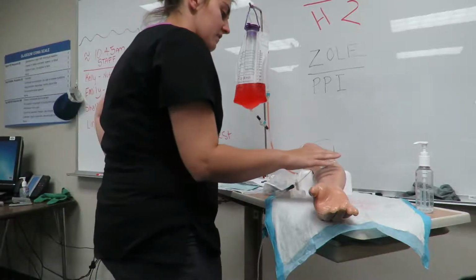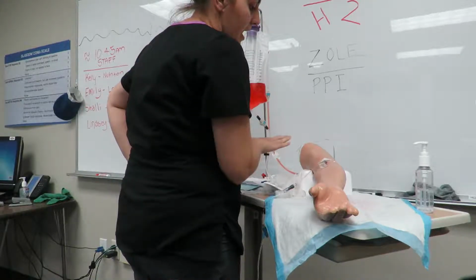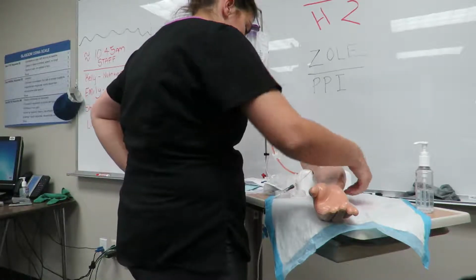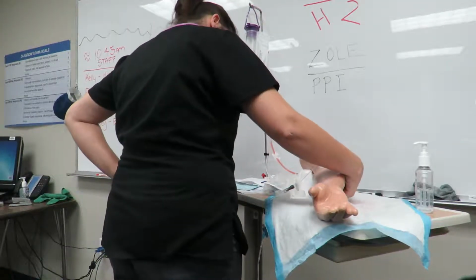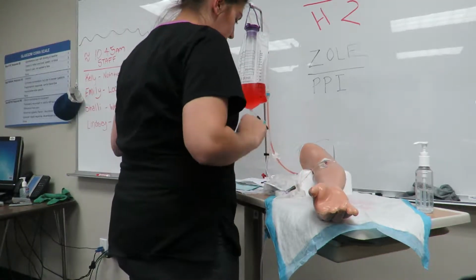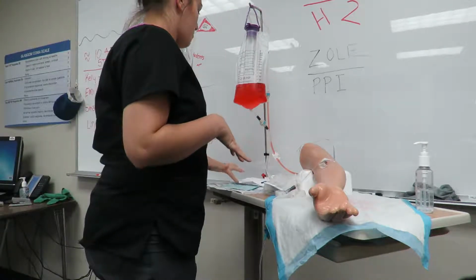Okay, Joe, I've started your IV. Everything looks good. No signs of phlebitis, no red, warm, tender spots, no signs of infiltration, no cold, swollen areas. The IV looks like it's flowing just fine. Now we're going to go ahead and get the antibiotics started that your doctor wanted.